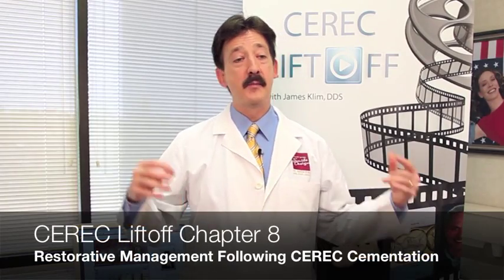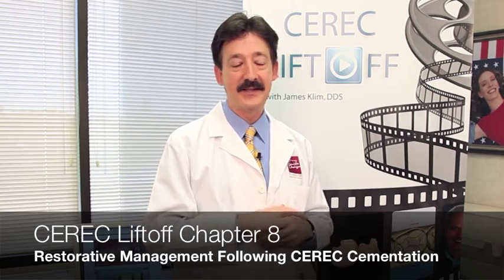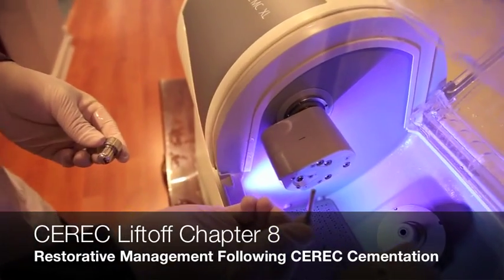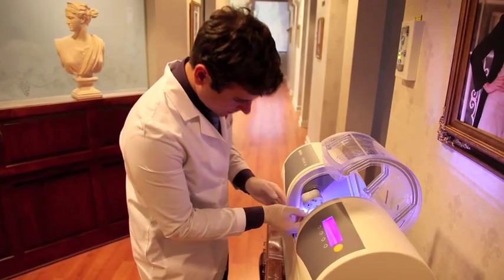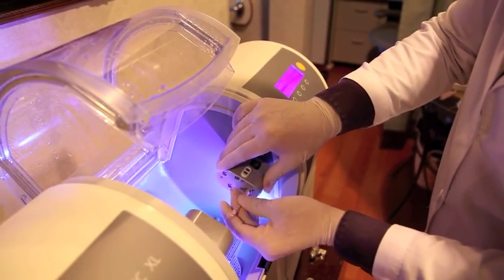Chapter eight deals with what you do once the CEREC is in. It deals with troubleshooting, communication to our clients, principles, and also taking care of your MCXL. You have to change the lubricant in your MCXL and maintain it so it purrs like a kitten and gives you great milling.